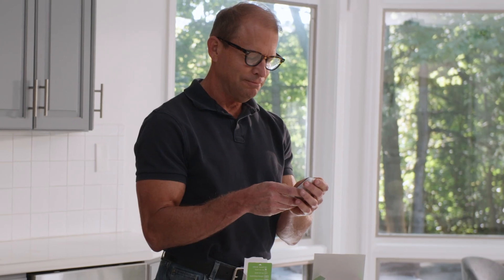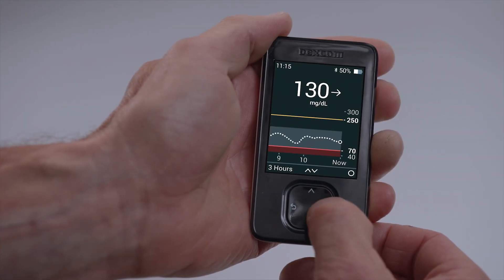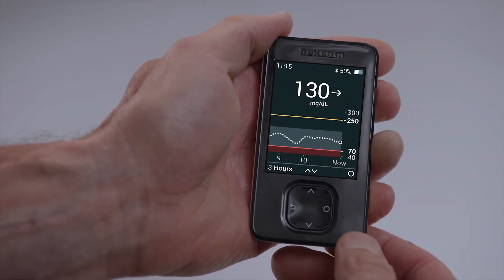That's it! You have successfully set up your Dexcom G7 receiver. After your warmup, you will get your first reading. To ensure you always have the best receiver experience, regularly check and update your receiver to the latest software. To do this, simply visit clarity.dexcom.com on a desktop computer, connect your receiver, and follow the on-screen instructions.